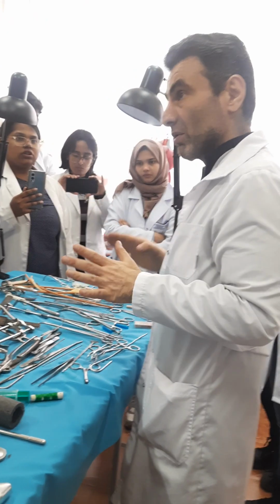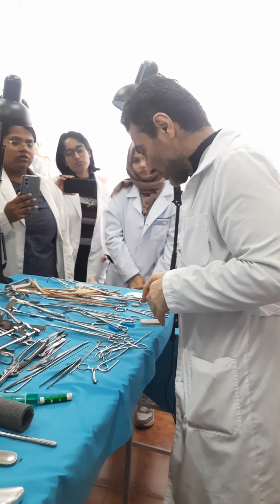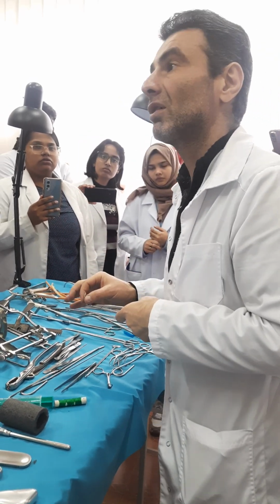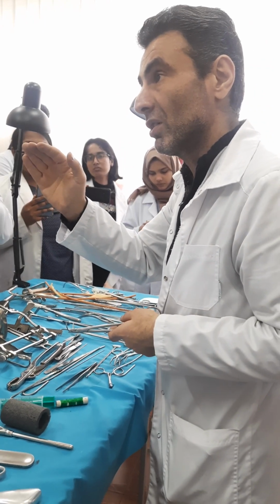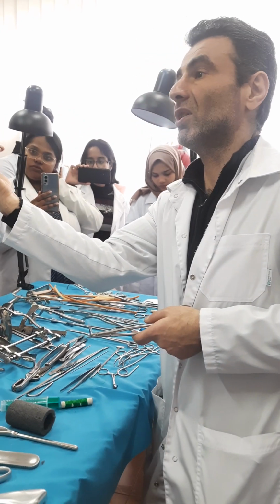Is it understood? Let's remember, please. Traumatical, atraumatical, straight, curved. Next classification: all needles, doesn't matter, traumatical or not, can be piercing and cutting. If you make a cross-section of a piercing needle, like your home needles, you will see a ring. It has an absolutely smooth surface and only a sharp tip.